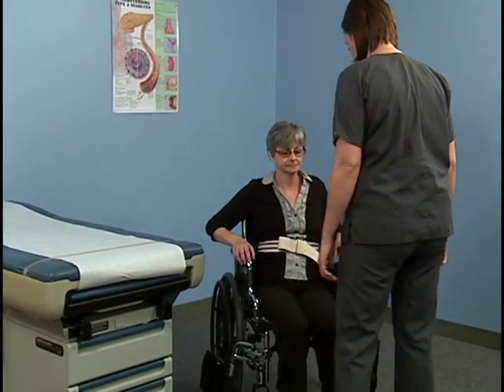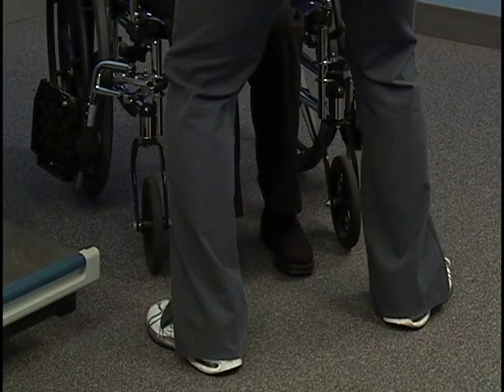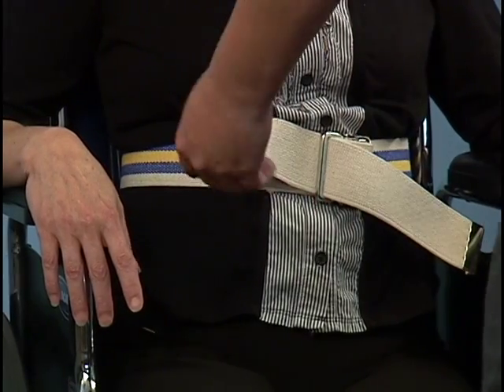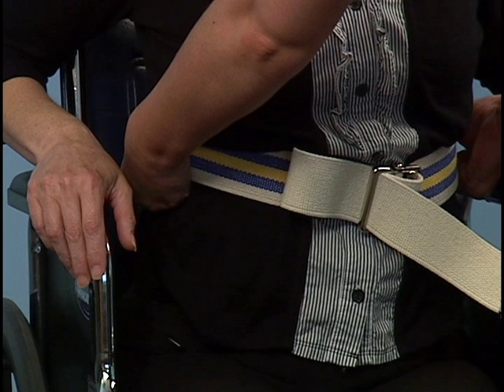Stand in front of the patient with your feet about 6 to 8 inches apart with one slightly forward. Point the toes outward and bend the knees slightly. This position provides a wide base of support for the transfer. Ask the patient to place her arms on the armrests of the wheelchair and to lean forward.